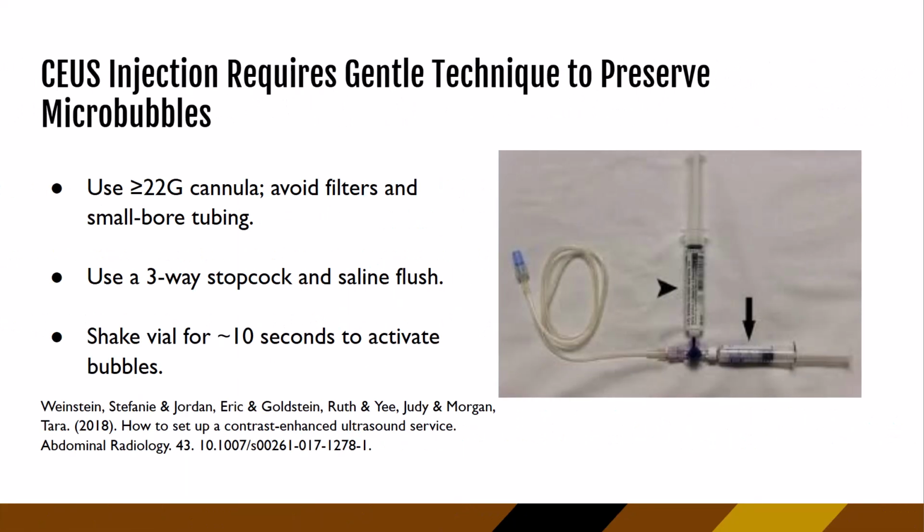When we were talking about contrast agents earlier, we were talking about how they have that shell around them, and that shell needs to be sturdy enough to allow for the bubbles to make it into the bloodstream and then interact with the sound wave itself. But they are still pretty fragile.